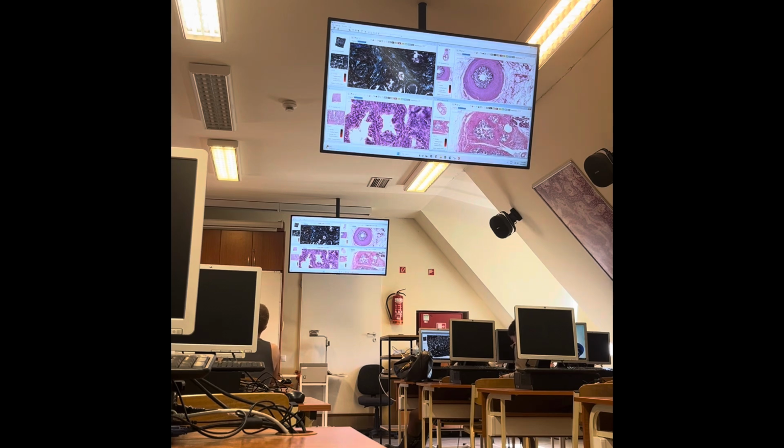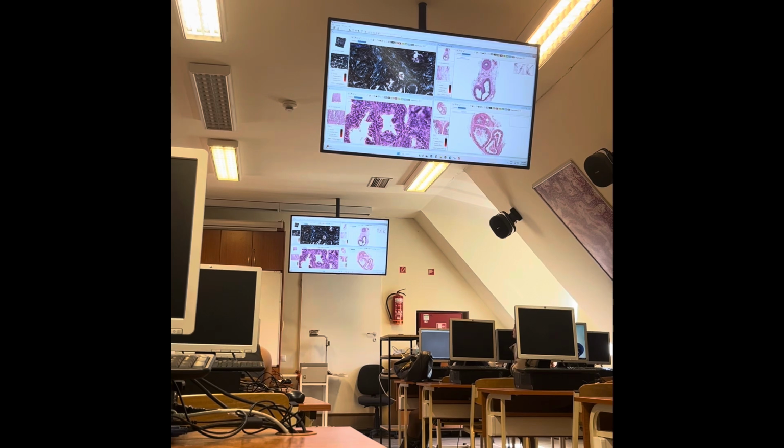If you just compare them together, what are the major differences? Basically, these are not that different, but if you look at the two of them together in small, then you will see that in the upper case, the two organs are at a distance, so there is obviously a layer of adventitia, loose connective tissue, in between the two organs.